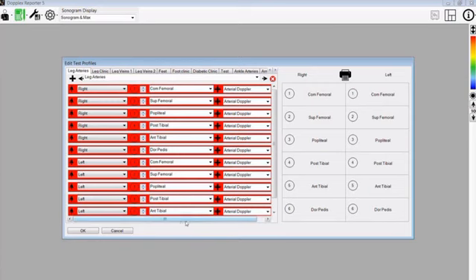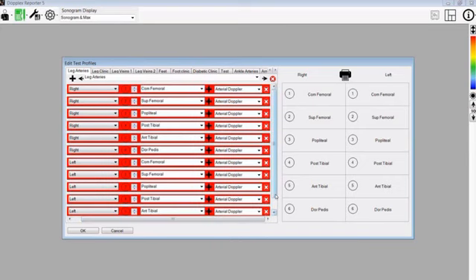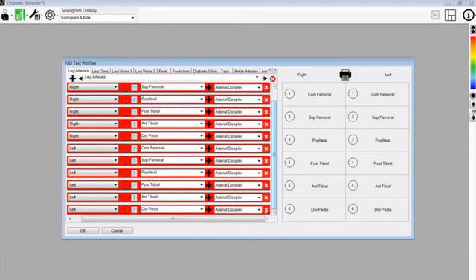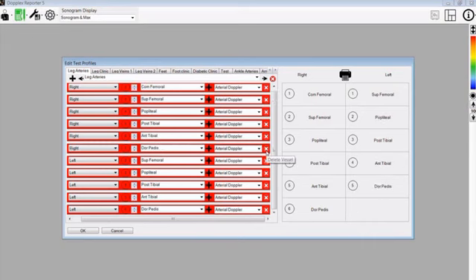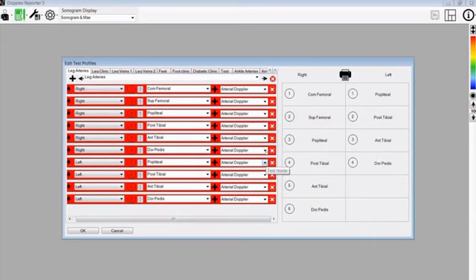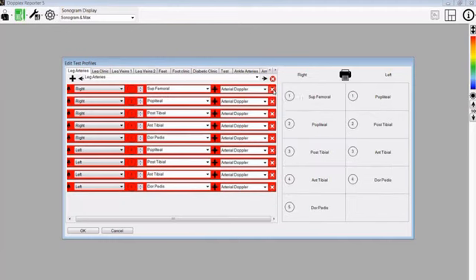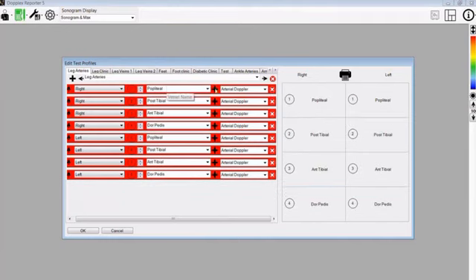First of all, we will show you how to edit an existing profile. If there are too many vessels that you want to do on the leg arteries test, then you can easily delete some of these by selecting the red cross on the right hand side. For instance, we do not want to do the femoral artery or the superficial femoral artery, so we can delete those from the profile and also at the top of the list. Now we are left with the remaining vessels.